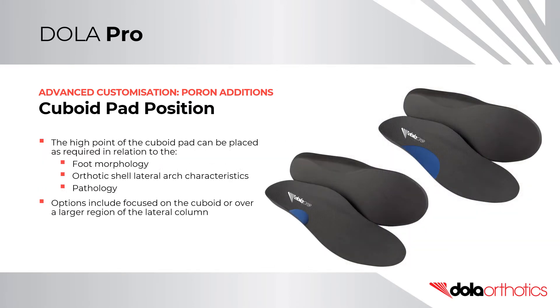The height point of the cuboid pad can be placed as required in relation to the foot morphology, orthotic lateral shell arch characteristics, or pathology. Options include it focusing on the cuboid or spread over a larger region of the lateral column.